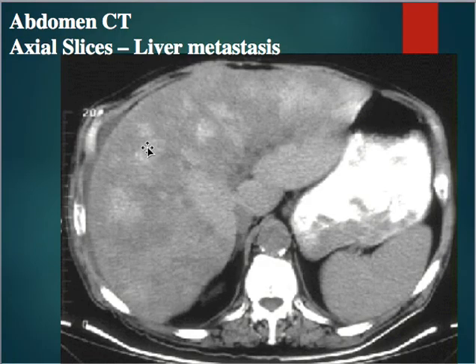This is liver metastasis, so this is where the cancer has metastasized to the liver, so you can see all these spots throughout here. And then again, you've got spleen, and then here's your stomach.